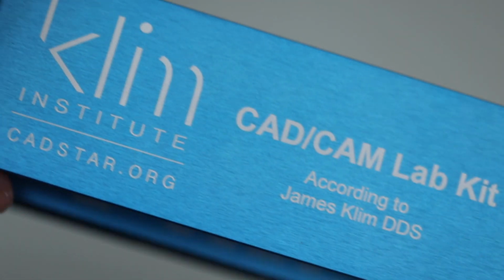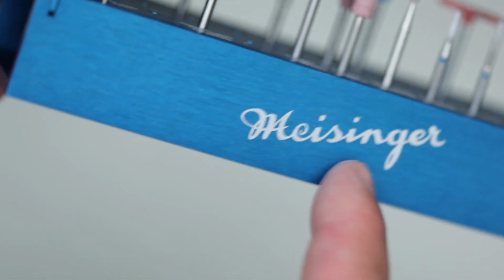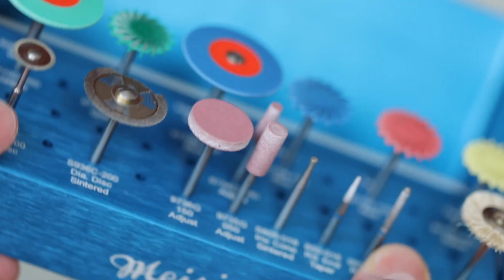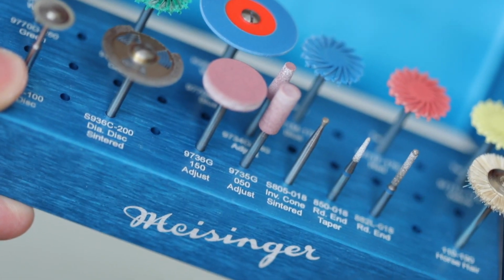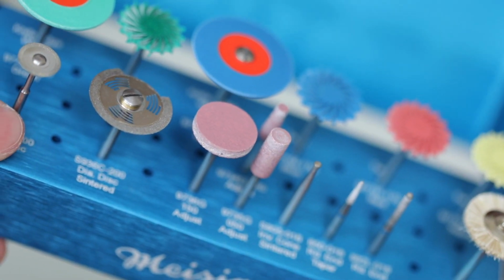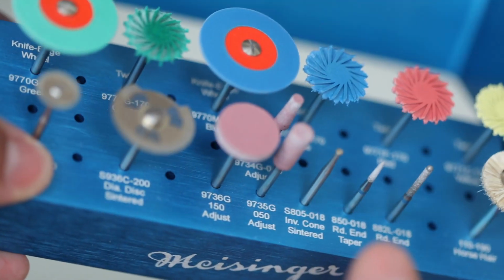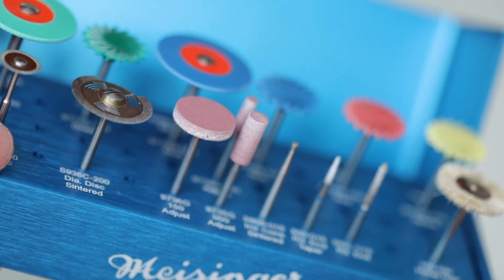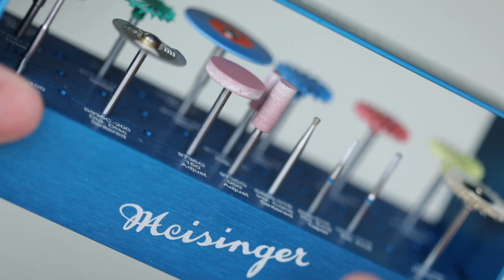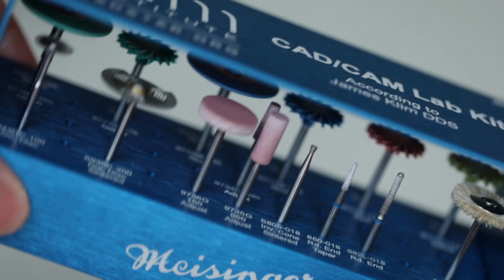All right, so to remove the sprue, I'll be using this CAD/CAM lab kit made by James Klim. This is from Meisinger, so he partnered with them to make this. If you don't know who Dr. James Klim is, he's a big figure in CAD/CAM dentistry. He has his own CAD course online, CAD Star, part of the Klim Institute. Great clinician, very knowledgeable guy. I've learned a ton from him in regards to CAD/CAM. This kit's awesome. If you're working with e.max or any ceramic or porcelain, I probably wouldn't use it for zirconia, but if you're using feldspathic, Empress, or e.max, this is a great kit.